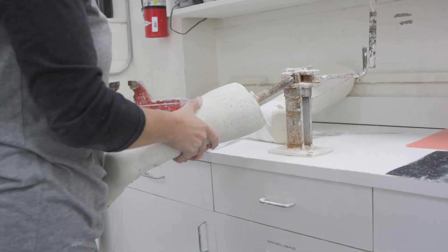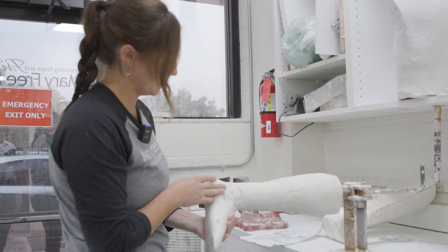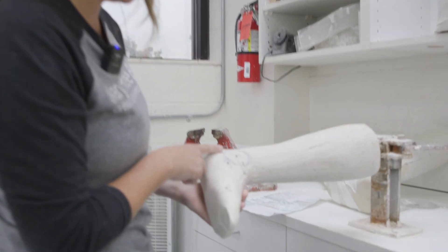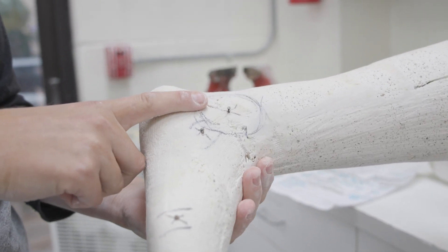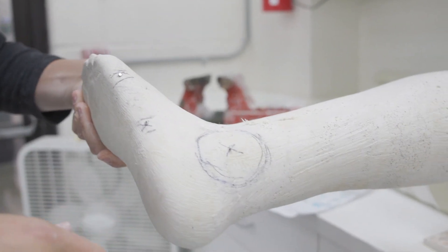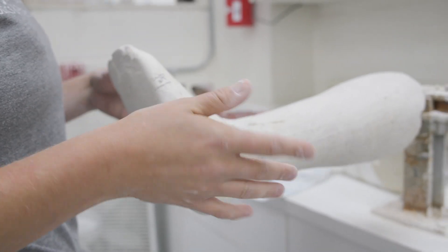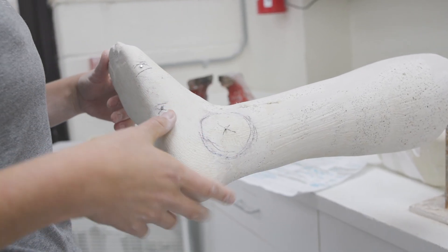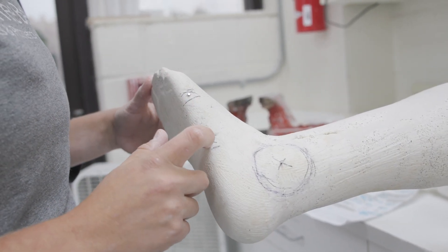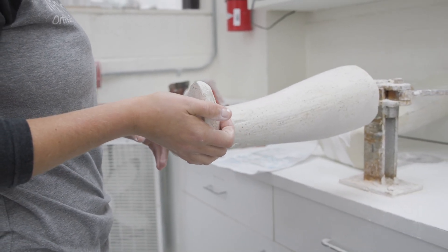You also have to look at the cast height, and that will be marked. The main areas that we have to build up on are the ankles, the met heads, navicular, and base of the fifth. We usually do about three-sixteenths — every case is going to be different — but three-sixteenths on the ankles, about an eighth on the mets. Depending on how bony these are, we'll do larger build-ups on those.